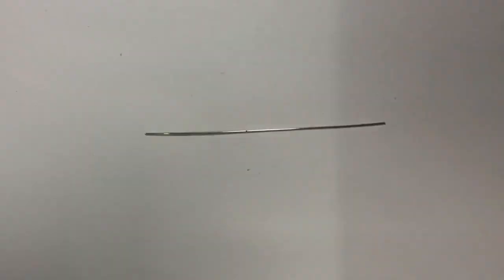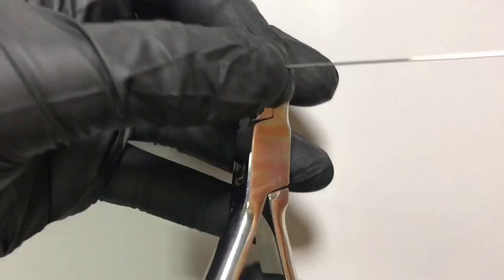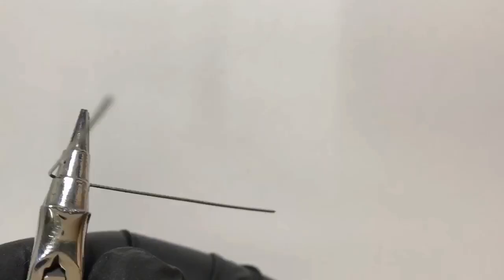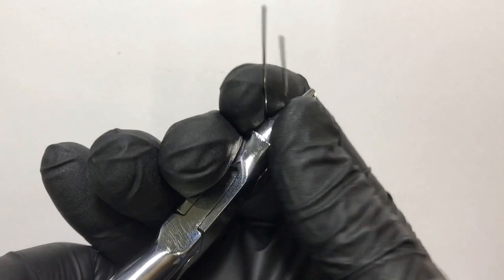In the second step we will mark a center point — this will be the point where our u-loop is formed. We engage this point in the middle rounded circular portion of the universal plier and roll out both ends simultaneously to form a uniform u-shaped loop.